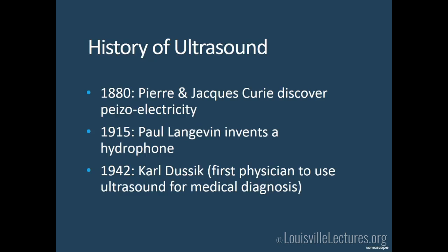Piezoelectricity is the concept that if you have piezoelectric crystals and compress them or put pressure on them, they generate an electric current. The opposite is also true: if you charge a piezoelectric crystal with electricity, it will change shape and emit sound waves — and those are the sound waves used by our ultrasound transducer.